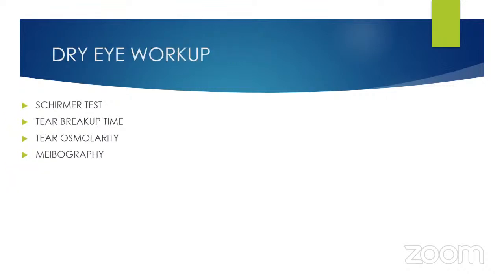Then coming to dry eye workup, Schirmer test, tear breakup time, tear osmolarity, and meibography, if available, is also done.